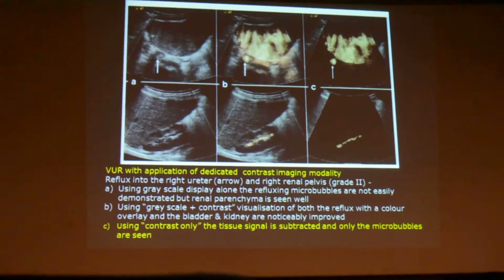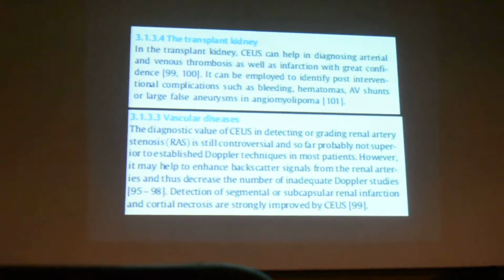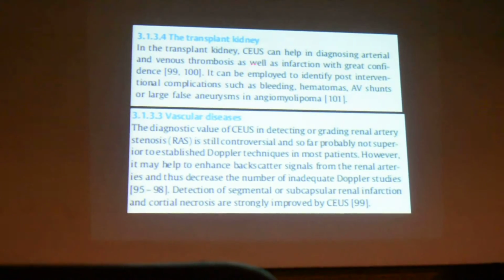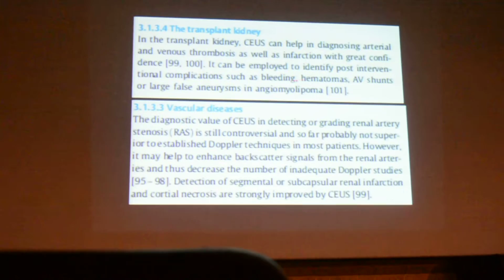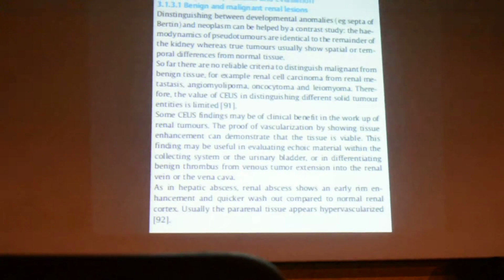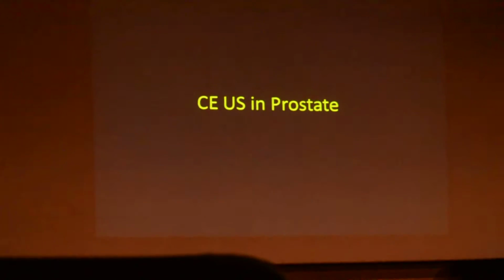So it's very useful and very informative, and it can be used for diagnosing various pathologies in the kidneys as well as transplant kidneys, where we can see any thrombus or infarctions and vascular anomalies, stenosis, and also to interpret benign and malignant lesions.